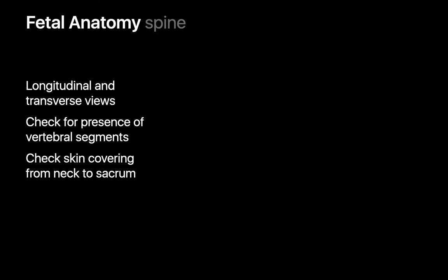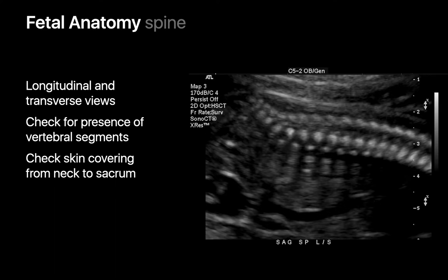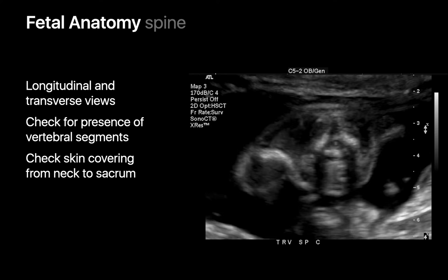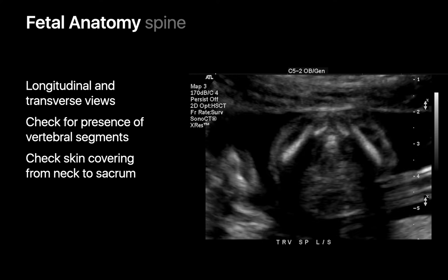Next, we assess the fetal spine. We check that each vertebral segment is present and appears normal, and we confirm that the entire length of the spine is covered by skin. To do this, we evaluate the cervical, thoracic, and lumbar spine from a sagittal perspective and also orthogonally in the axial plane.